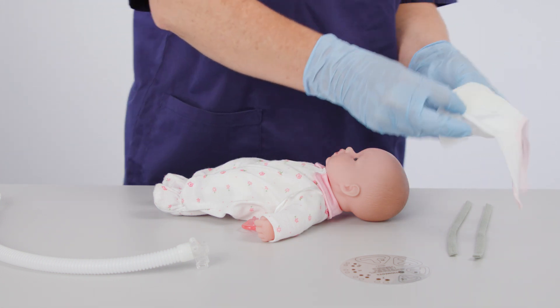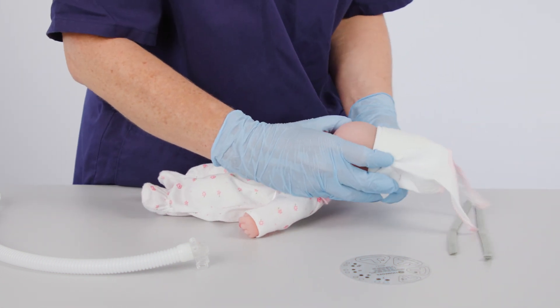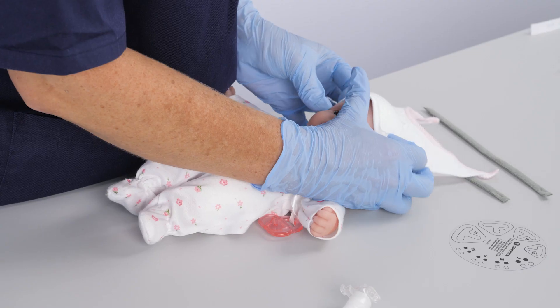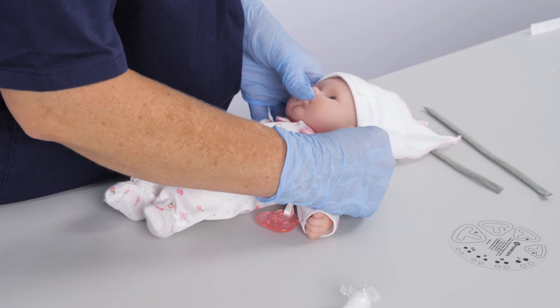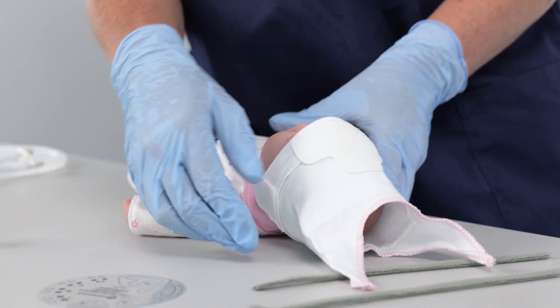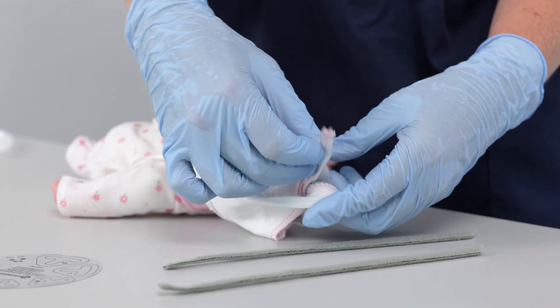Place the bonnet on the infant's head and ensure the front triangle is located in the middle of the infant's forehead and that the ears are slightly covered. Secure the bonnet onto the head using the ties at the top of the bonnet.